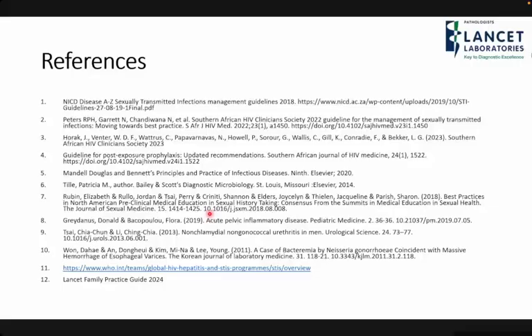No, even if you have your Haemophilus ducreyi, because it's a genital ulcer, if you have your chancroid and an ulcer, then you swab the ulcer. Yeah, monkeypox as well, you swab the lesion.